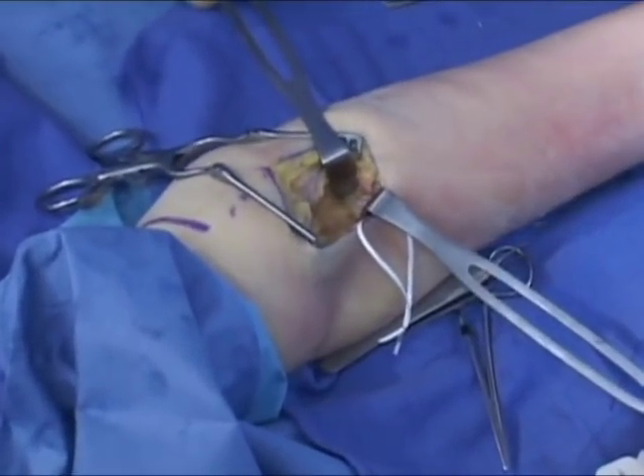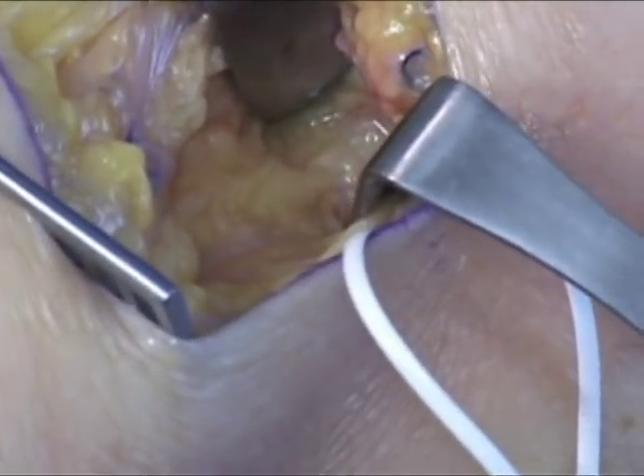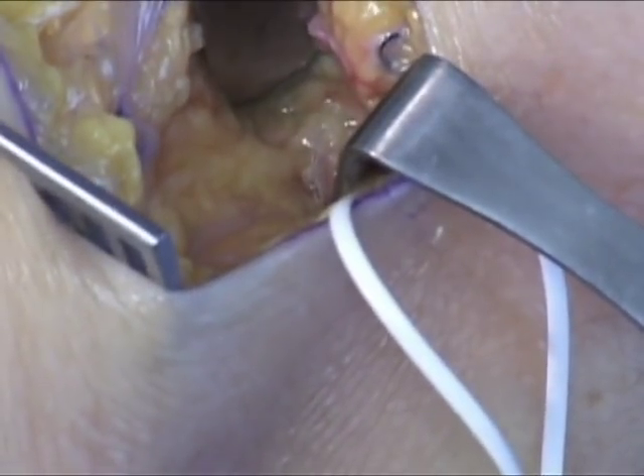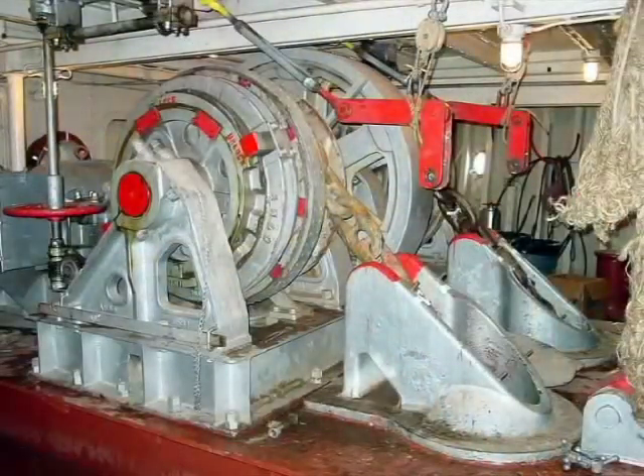A close-up view of the biceps tuberosity in full supination identifies it to have a large footprint where the biceps tendon inserted. The biceps tendon inserts on the ulnar side of the biceps tuberosity, giving it a windlass effect with supination and pronation of the forearm.